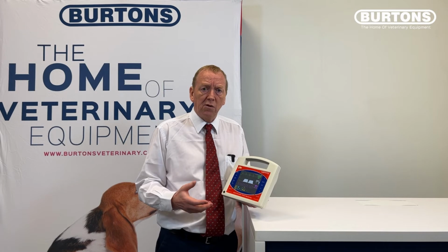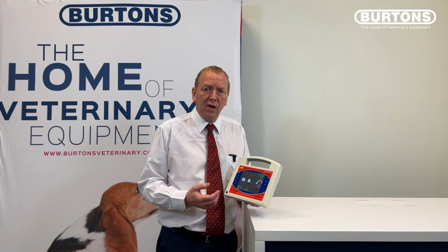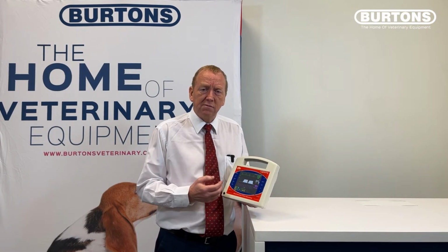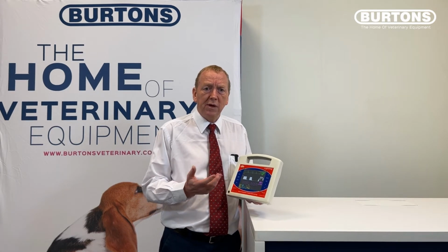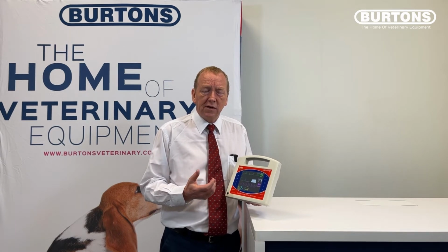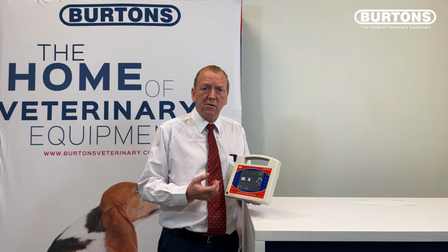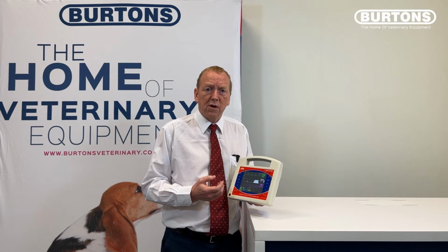And by the same token, we're supporting high respiratory rates as well to support those rates found across the species. The other thing, which may not immediately be obvious, is something like the sampling rate for the CO2 system. On our side stream systems, we adhere to the micro sampling rate of 50 mils per minute, which means it's roughly just under 1 mil per second sampling. And with careful attention to dead space and the setup and the positioning of the sampling point, we can adequately and nicely monitor animals down to sort of 150, 200 grams. So it is quite practical to monitor the CO2 output from, say, an African grey.